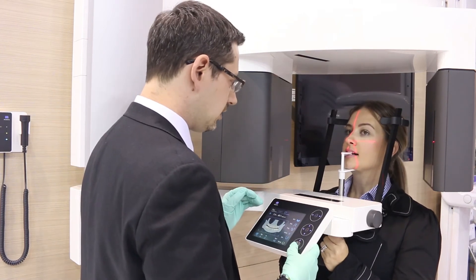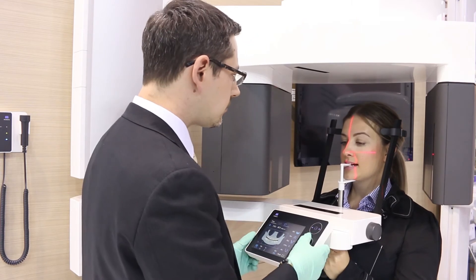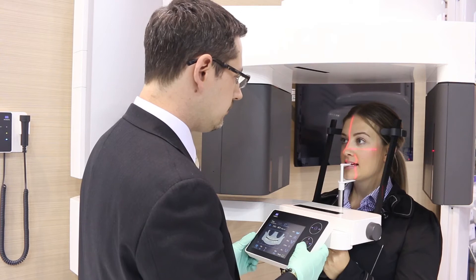Using the control panel, now lower the patient arm until the anterior section of the Frankfurt plane laser beam aligns with the patient's lower orbital.